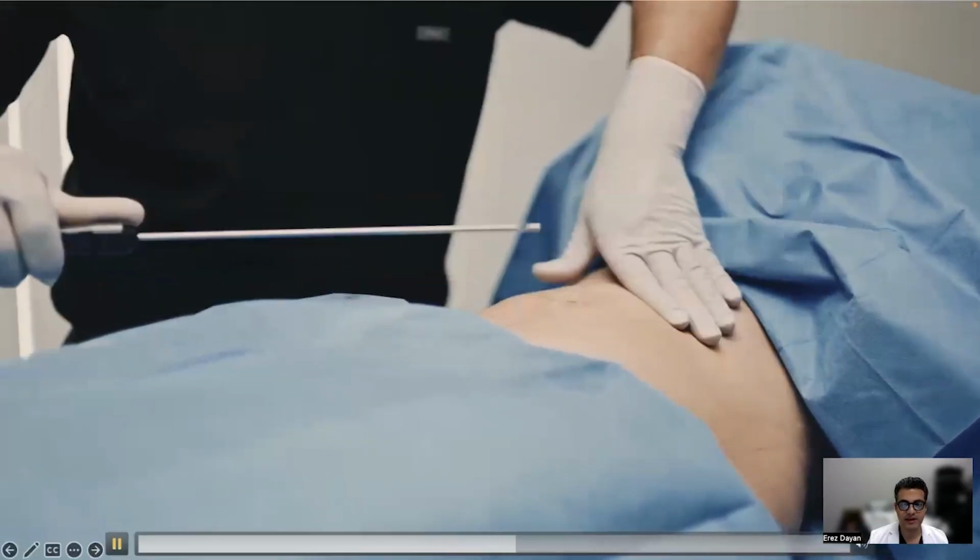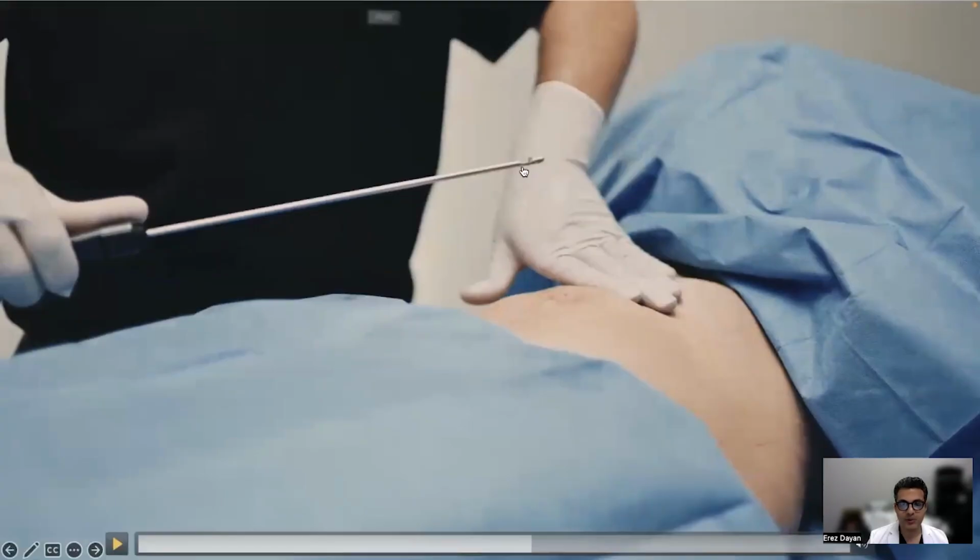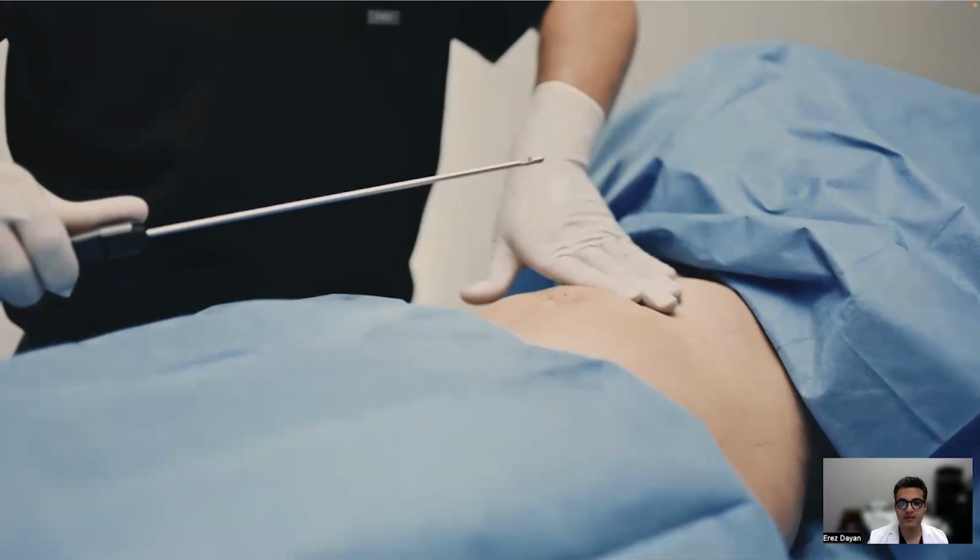I'm identifying, I know where the actual hole is on my cannula, so I know where the suction is actually happening. And my left hand is critical to feel how thick the skin envelope is there, where I want to suction more, where it's thicker, and where I want to avoid suctioning, where I've already suctioned.